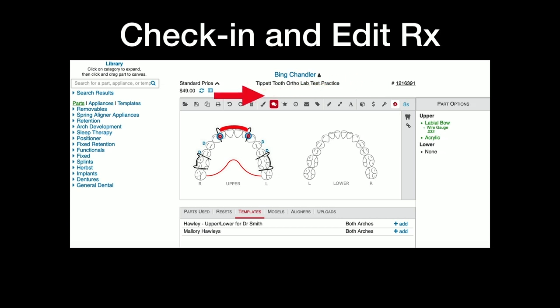So there's view. Oh, that's what you click on. That's the EasyRx number. So that's the number of that script. And it's unique to this patient. Nobody else in all of EasyRx's database has that number. So it's very HIPAA compliant. All their servers are HIPAA compliant, so you don't have to worry about that. And then, like, no more emailing STL files and stuff like that.